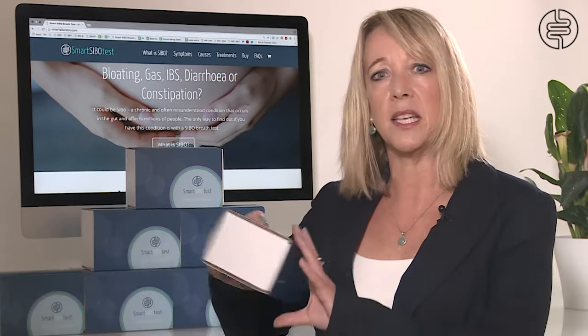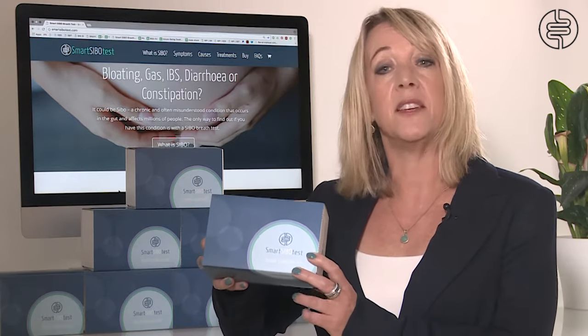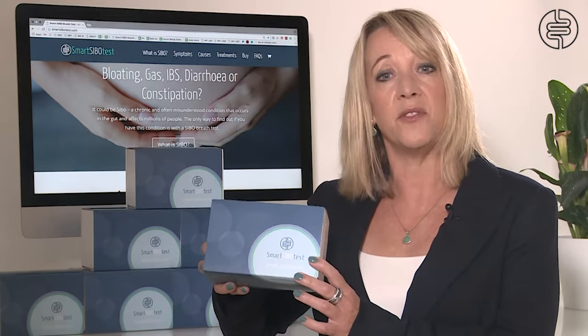The kit that you receive will look like this and will include all you need to complete the collection of samples easily from the comfort of your home. You will receive a full set of instructions about preparing for the test and how to collect your breath samples, plus we have a video demonstrating how to collect samples on our website.